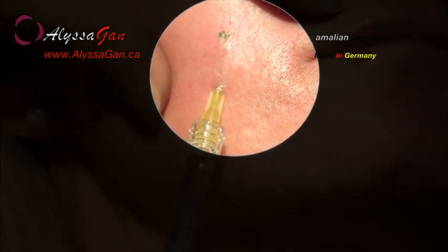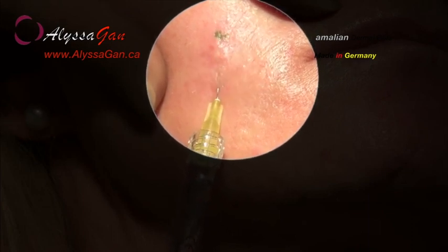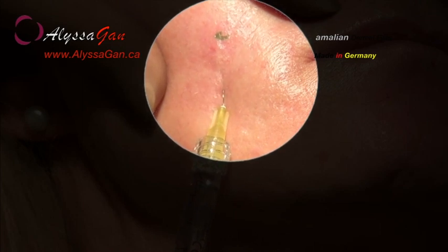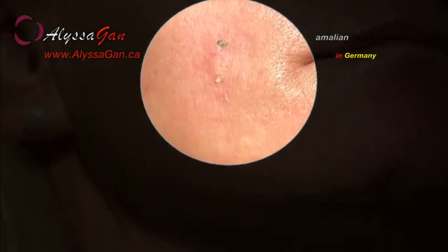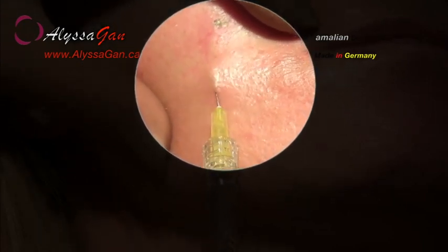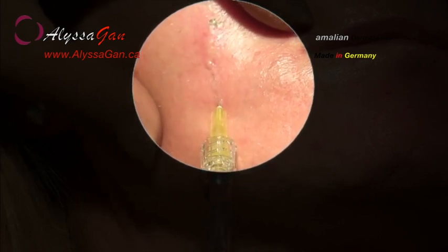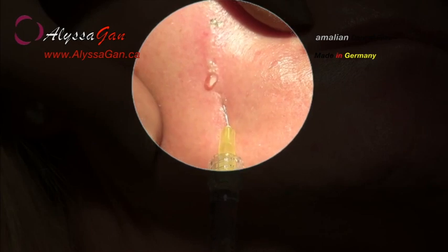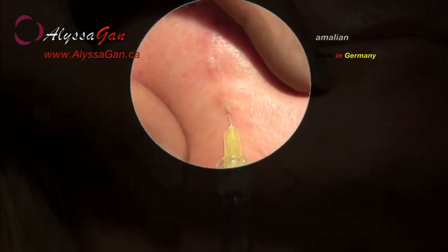Here, the needle can be seen very clearly at a superficial level in parallel to the skin surface. In this treatment, a slow injection is crucial to avoid the hazard of bump formation. The exactly positioned implant is clearly visible. There are in fact patients where this indication lasts for 2 years. The leaking droplet indicates that the injection was slightly too superficial. However, this also depends on the individual condition of the skin and on the pore size.